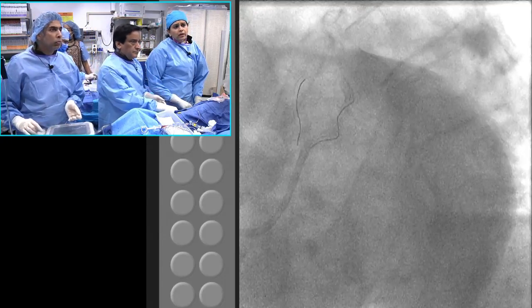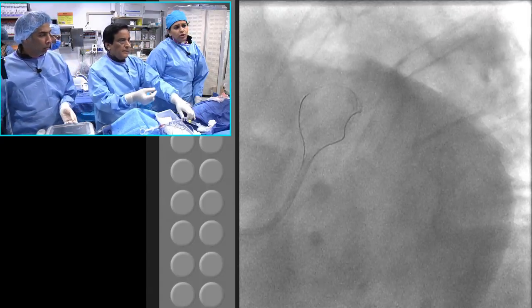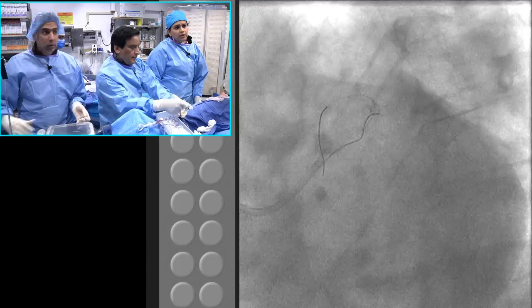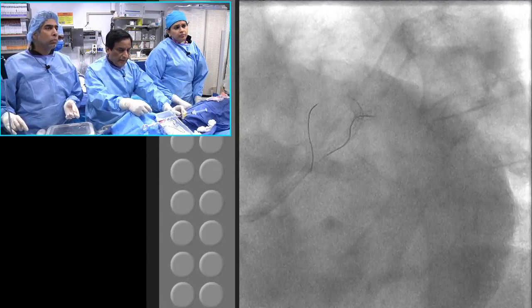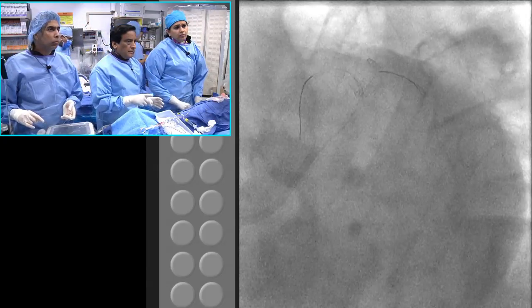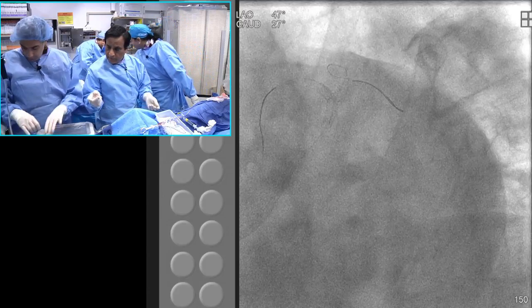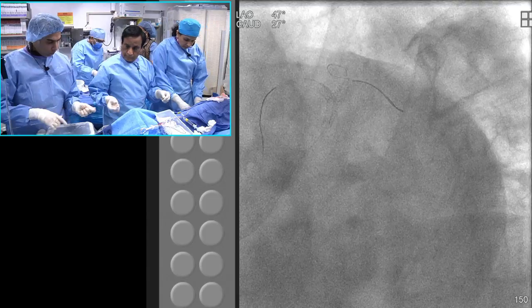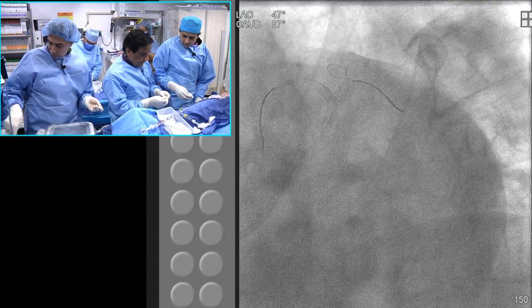You want to get vasodilators first? Yeah, let's go with the vasodilator. No, not that. What I'm saying is let's get a Twin Pass and go in with the vasodilator. Okay. Good. Open the nitroglycerin, mix it. Do you want to go to the view? Now what we need to do is just give a balloon, just go back and forth. Planning to go a little more distally there? Yeah, that's exactly right. Get rid of this wire.